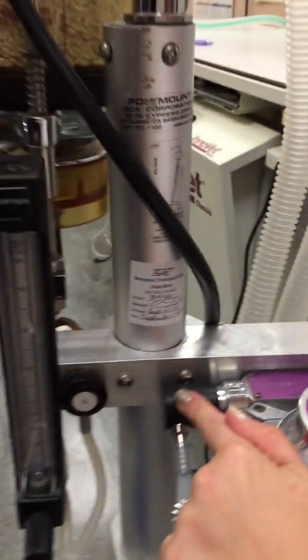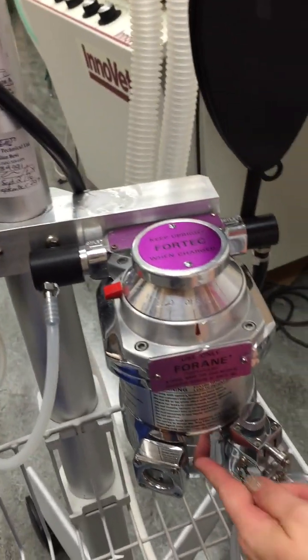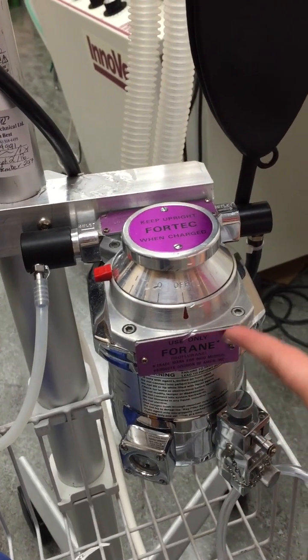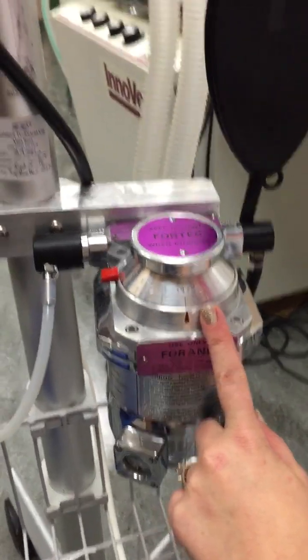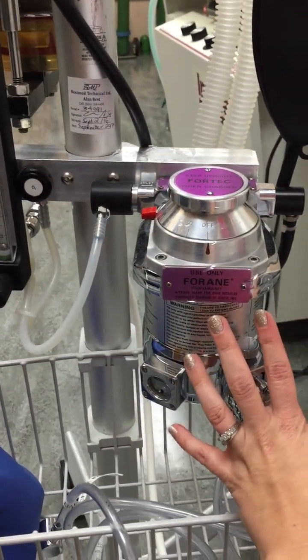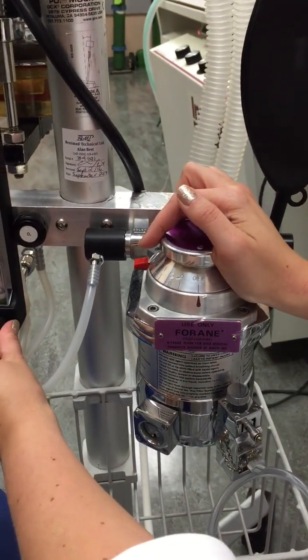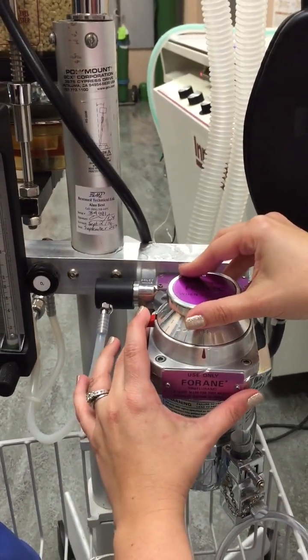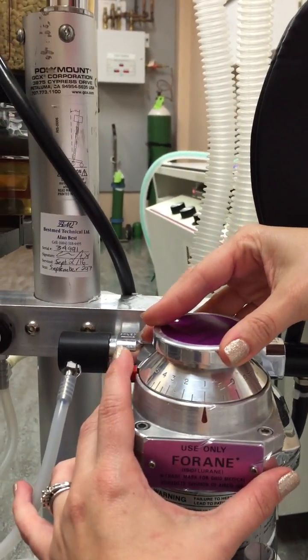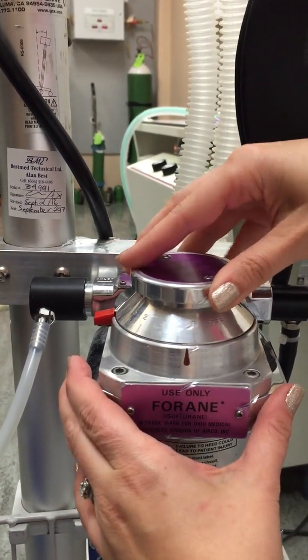Okay, from there, the oxygen is going to come into your vaporizer and pick up whatever percentage of isoflurane you have it set at. Right now we have it set to off, so if I had the oxygen on, it would not pick up any isoflurane. I have the oxygen off right now, so it is safe, but if I was to turn the vaporizer on, push this button, turn the dial, set it at my percent, it would then start to pick up 1% isoflurane.